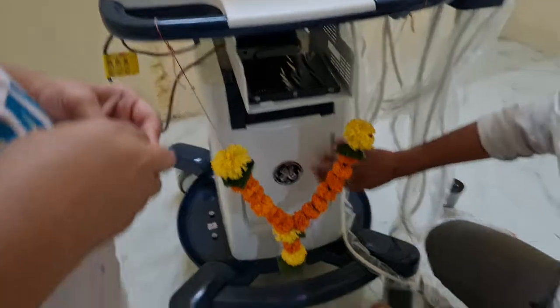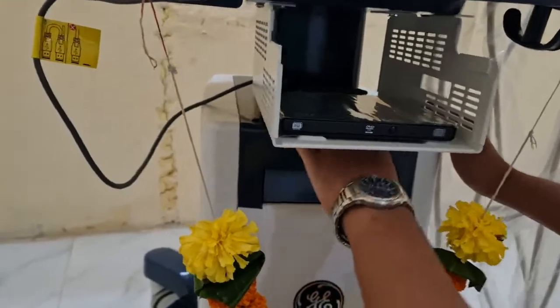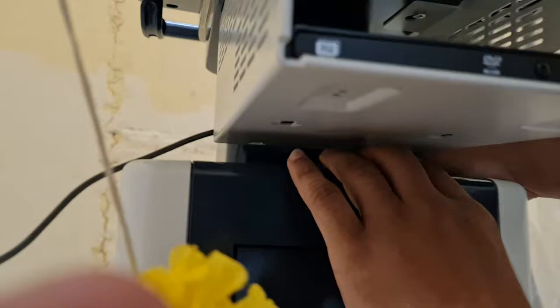Take the next one. So inside here, there is an air filter. Here are some slots to push outside, on the top. Or you can pull it from this side.